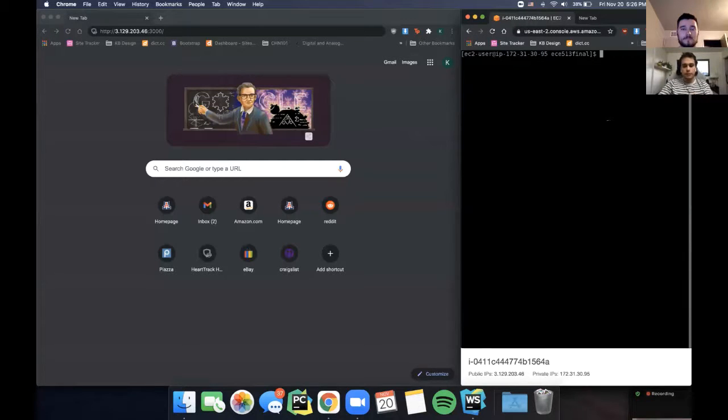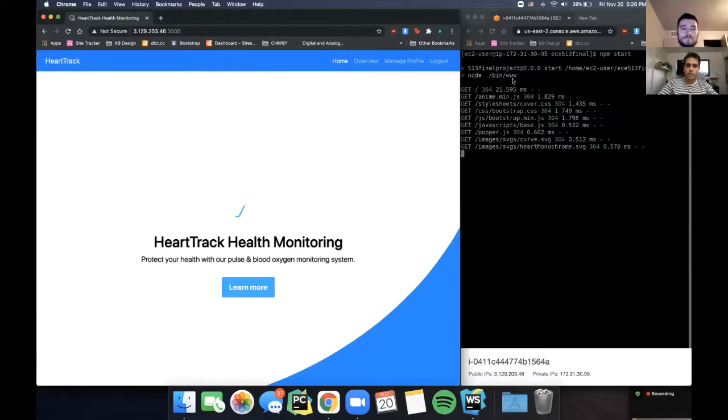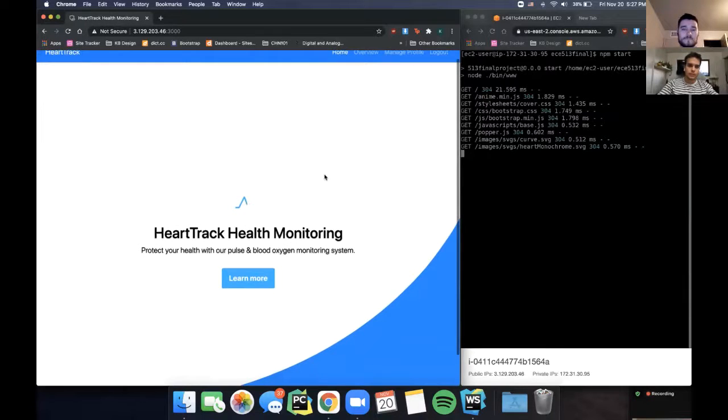So I'm going to go ahead and start our server. And I am hosting our server on an AWS instance, and I have attached an elastic IP address, so we have a more readable format. I'm going to go ahead and connect, and you can see our remote terminal logging all of our HTML requests.